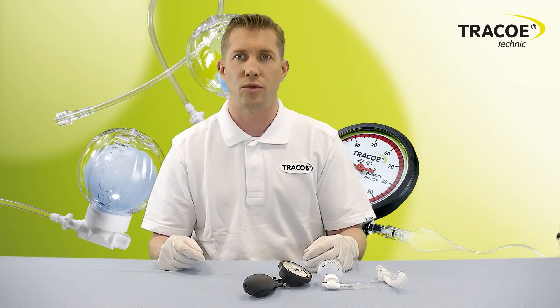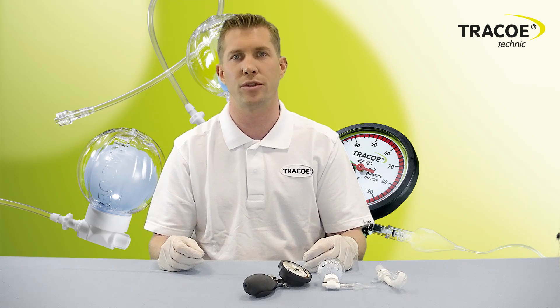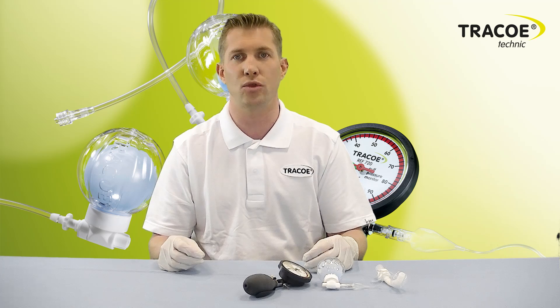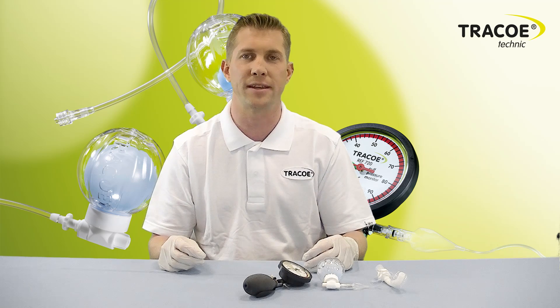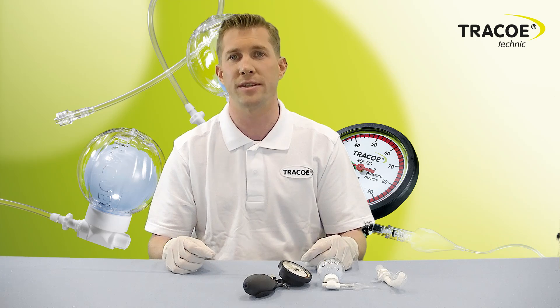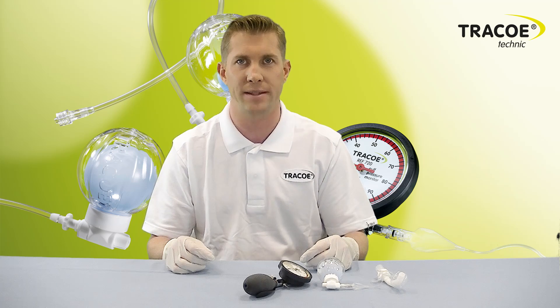The TracoSmart Cuff Manager continuously regulates the cuff pressure during air travel or emergency air transport, which is necessary due to varying altitudes. The TracoSmart Cuff Manager is a single-patient product that can be used for up to 29 days.